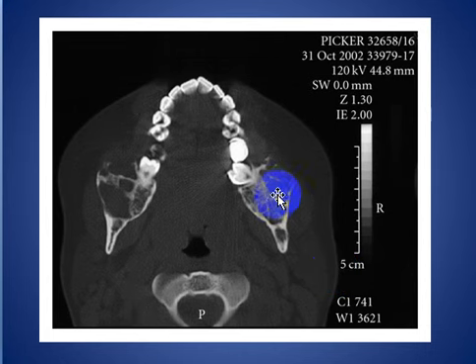Also here, the same patient with multiple lucent areas with bone destruction and cortical destruction, multilocular, involving the mandible and the ramus, angle of the mandible and the ramus in this patient with aggressive cherubism.